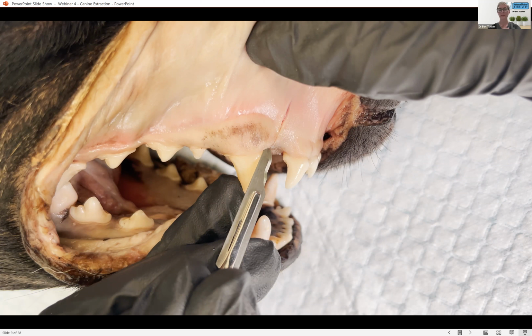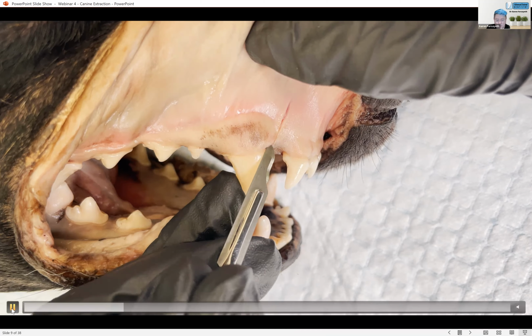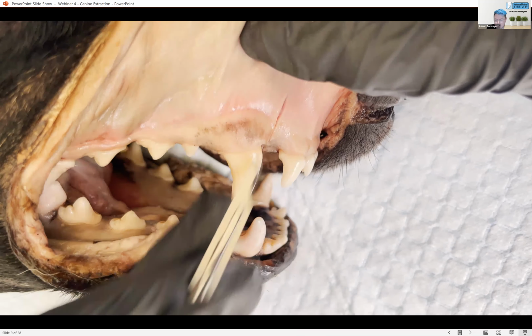There is a nice little blood vessel up there too. I just paused it here. You'll probably notice that after I made my incision at the corner of the flap, I inserted my blade and just rolled it. I find that's a really good way of lifting the corner of your flaps, one of the hardest things to get going and started. So you cut away from the actual flap towards the outside of the tissue. You insert the blade in and just roll it, and that will help lift that little corner for you. That works a treat for me. Tip number one. Yeah, that is a good one.